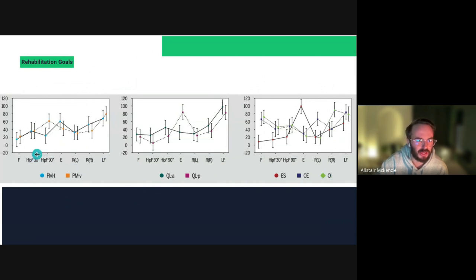So if we look here, where we started the hip flexion at 90, so relatively low muscular effort to the transverse part, bit higher on the vertebral part, so we can start to dominate load away from that aspect. Then as it comes more mid-range, we get a more equal effect, and the line of pull on the vertebrae will change slightly.